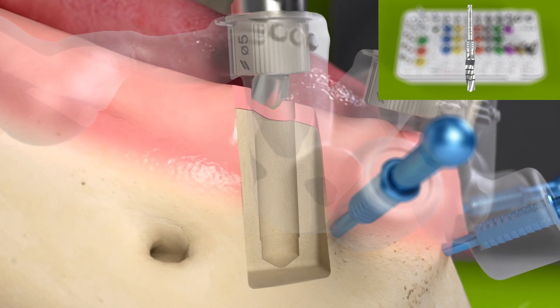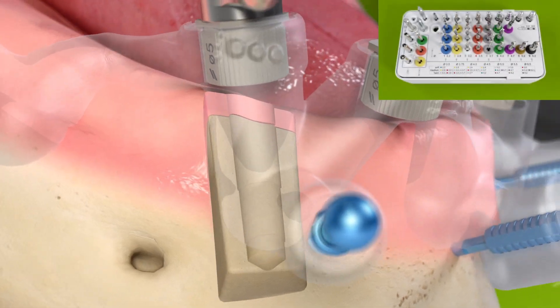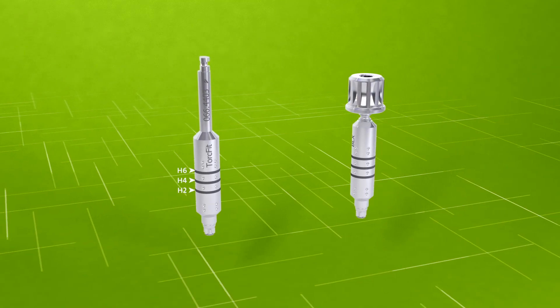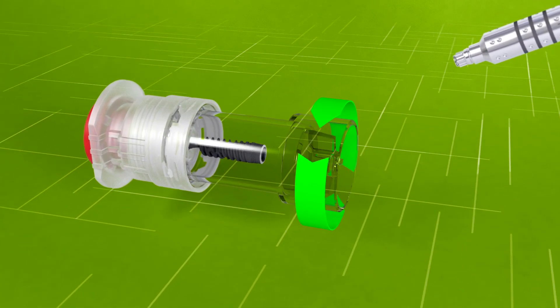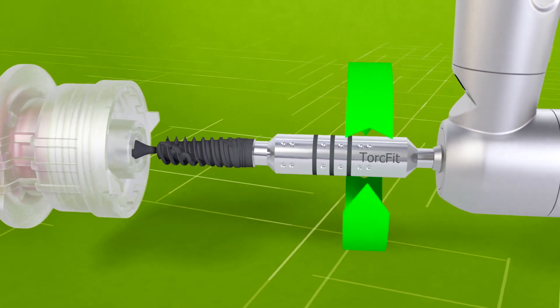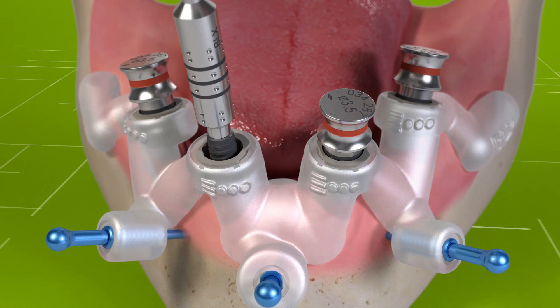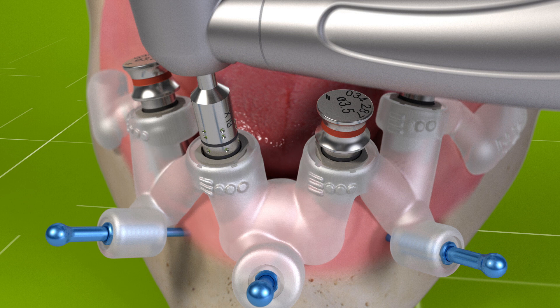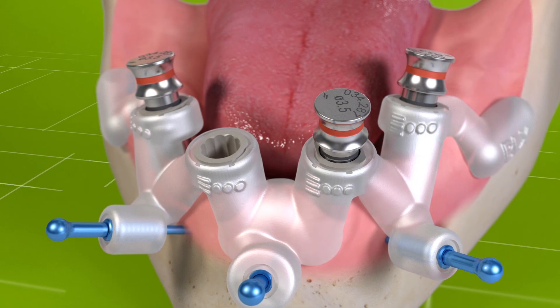Use the implant driver and stop when the implant depth reaches the H4 line. Align the orientation dots to the template markings. Vertically pull out the implant driver to detach.